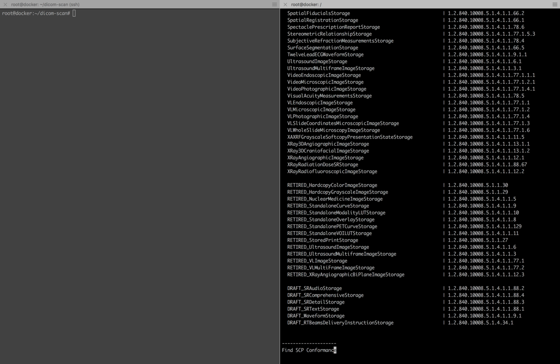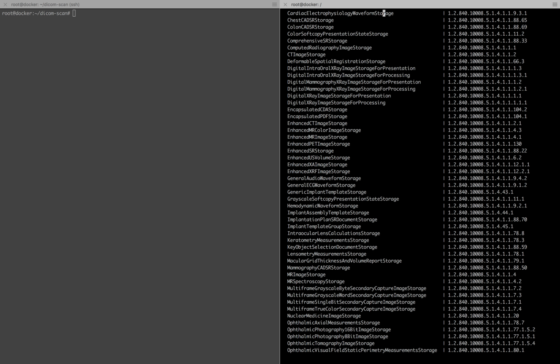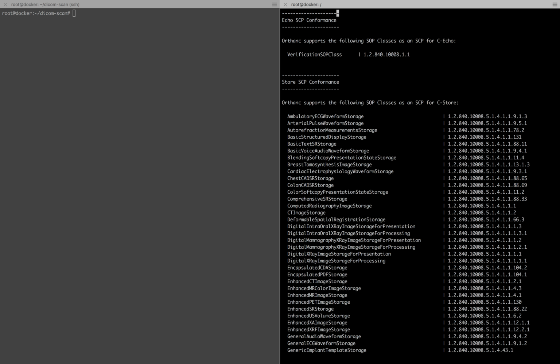The other thing I like about the DICOM toolkit that I did not see in PyNetDICOM is you actually get the new draft OIDs and the OIDs that are expiring. So it helps to eliminate the ability to put in legacy things that are no longer going to exist. Although, considering how often tech is refreshed in a lot of hospitals, some of the legacy things will probably still exist, where the drafts will take a while to actually be adopted. So we always have to take that in mind when we're looking at security things: how long does it take an organization to adopt new technologies, new OIDs, and so that will play a big impact on how long these things will exist.